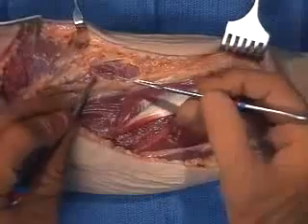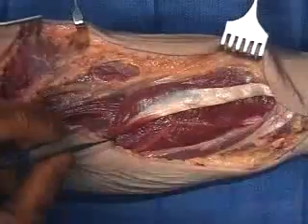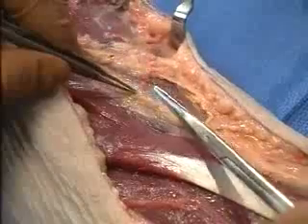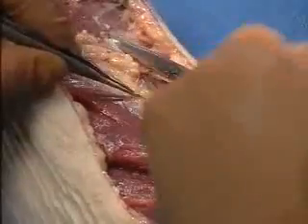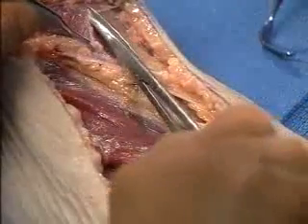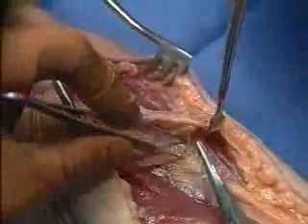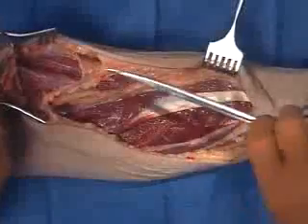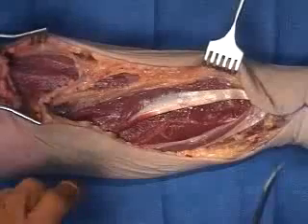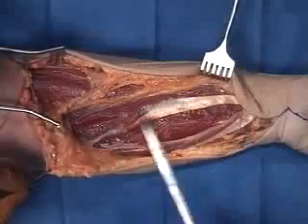We're going to move over here and release our mobile wad. We'll make an incision in the fascia and release that again with our scissors, all the way proximal. Okay. So we released our mobile wad. We released our anterior compartment.